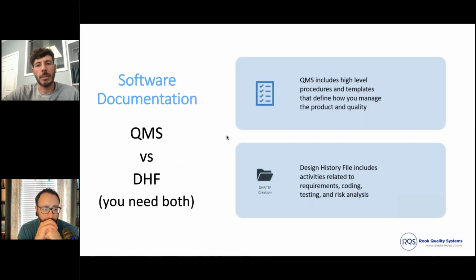Like we talked about with hardware and medical devices in general, there are different classifications based on risk. Depending on regulatory markets, those can be different as well. But for the US FDA, there's class 1, 2, and 3, and that would determine what testing is required for your hardware or software devices. There's additional classification for software, both with the FDA and with the IEC 62304 standard, that defines classifications based on risk as well. So that should be accounted for when you're developing your SaMD device.